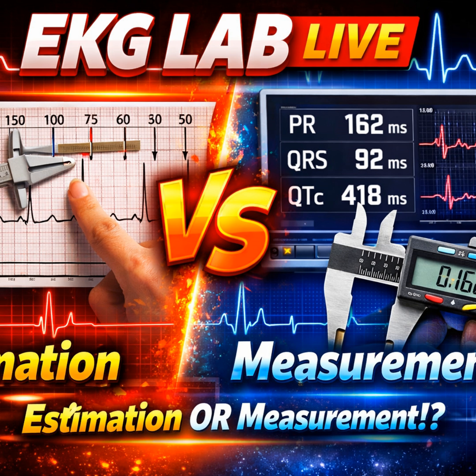Look, I am not saying the math is wrong. I am saying it is often impractical in the heat of the moment. And frankly, your rate-by-boxes method falls apart completely when the patient goes into atrial fibrillation. Real hearts, especially sick ones, are rarely perfectly regular. That is why I advocate for the strip method.